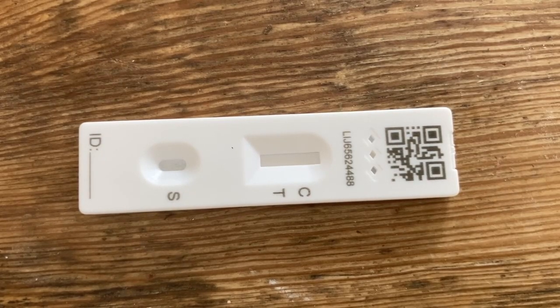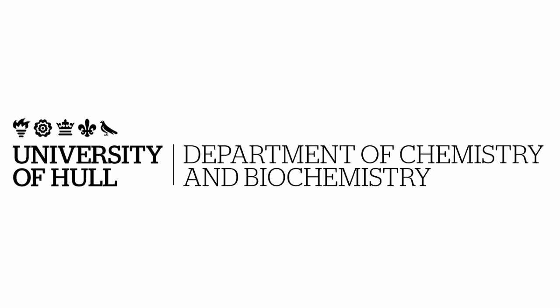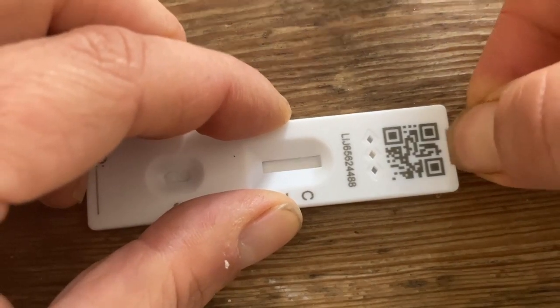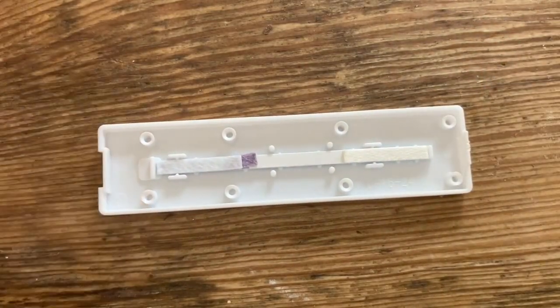So we've all been carrying out these lateral flow tests — let's take a look at what's inside one of these things. You can just open it up here. Really simple.